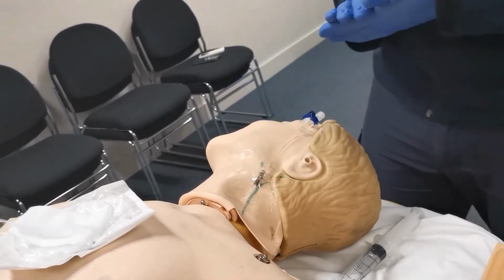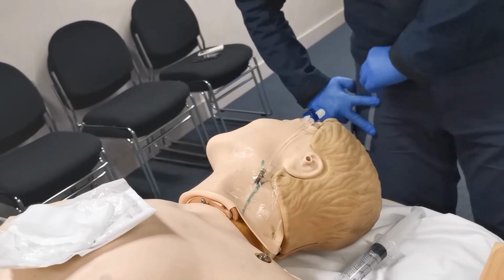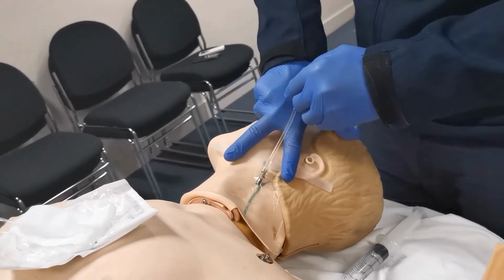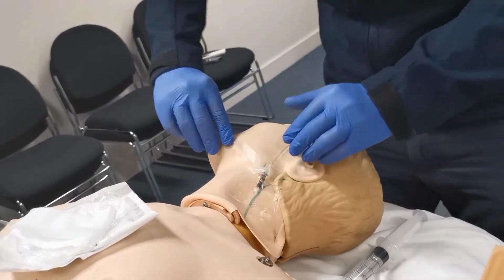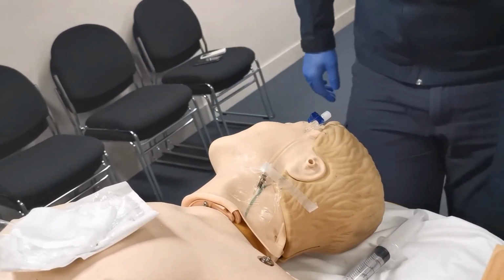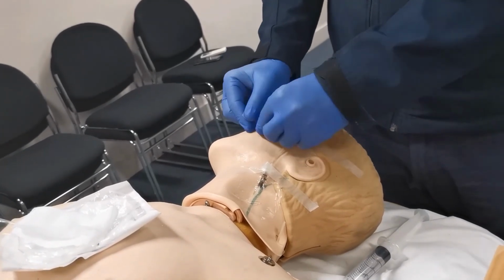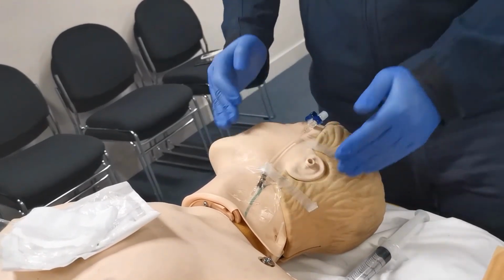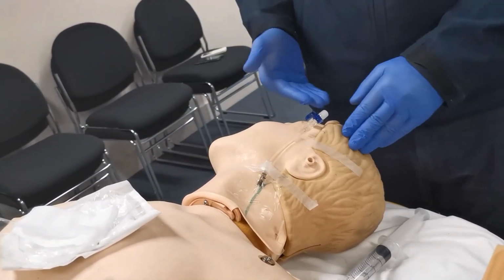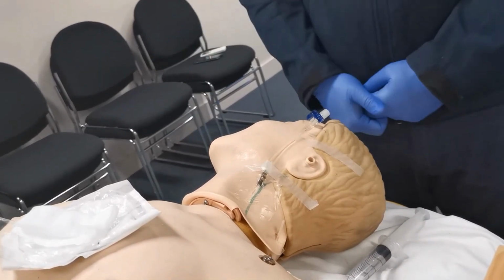Once you're happy your patient's vein has been accessed, tape it down as per normal. I personally like a chevron, which is just a simple loop over the J-loop extension to ensure stabilisation, and a second piece of tape. From here we can monitor for extravasation, administer any fluids we require or medications and so on. That is how you insert an external jugular vein.